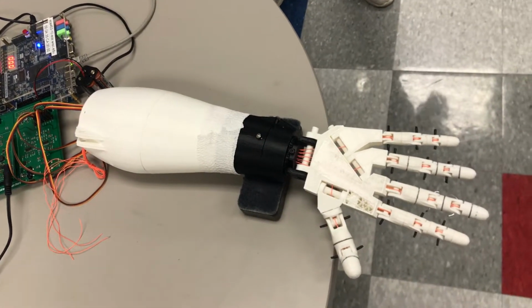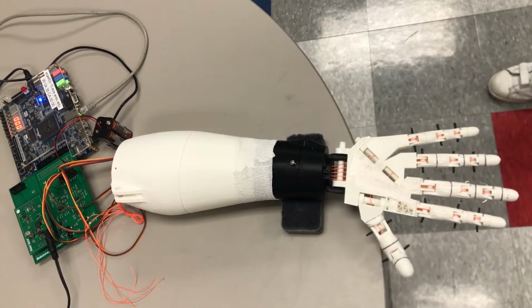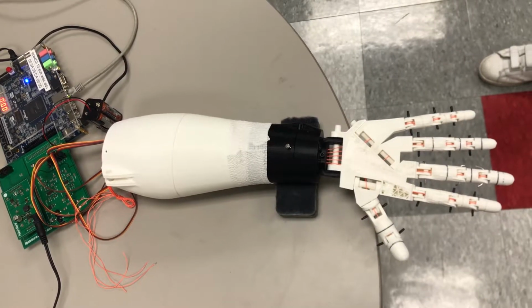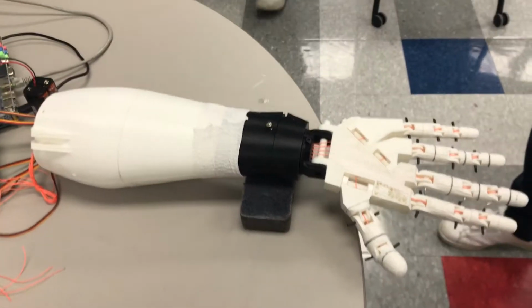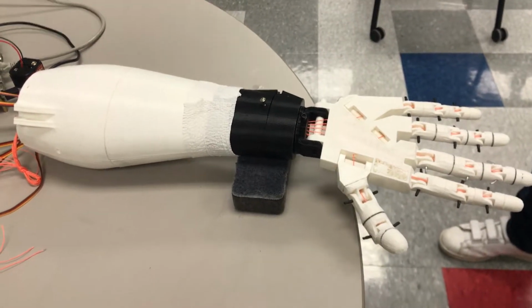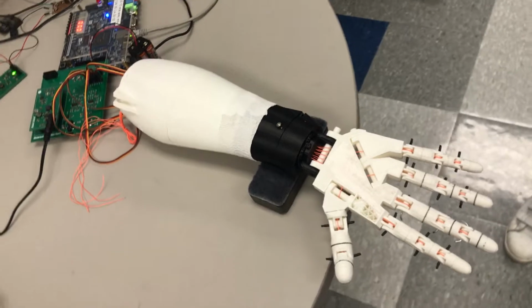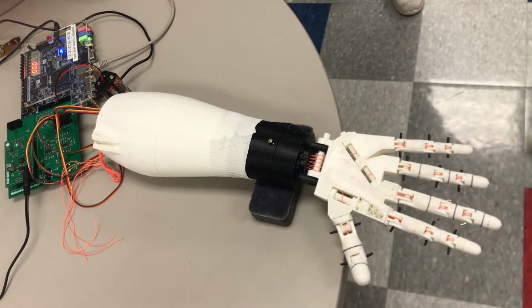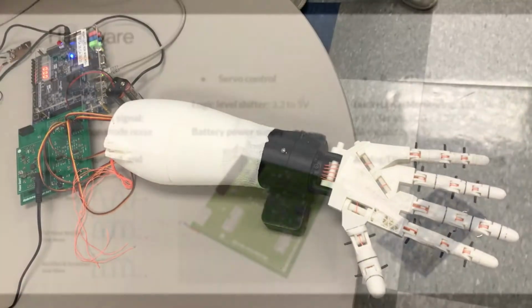This is our robotic arm, which is open sourced. So we 3D printed it and assembled that with some errors and imperfections. We already fixed that. So it is capable of the full 5 fingers movement plus the wrist movement. So next, we are going to show the integration of the system to show how this system works.